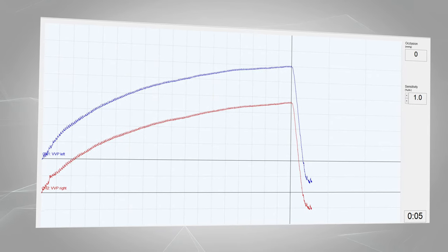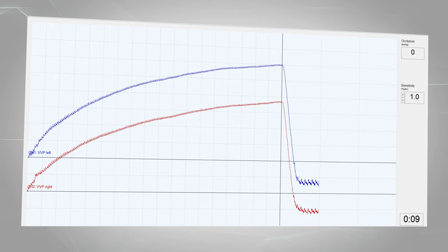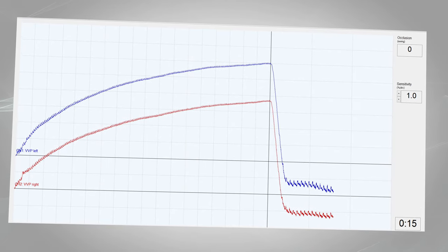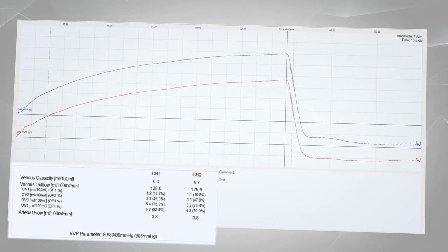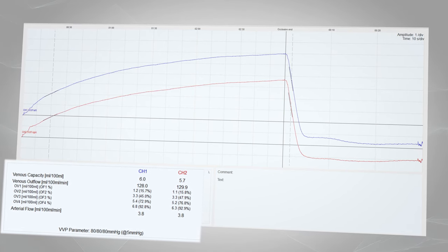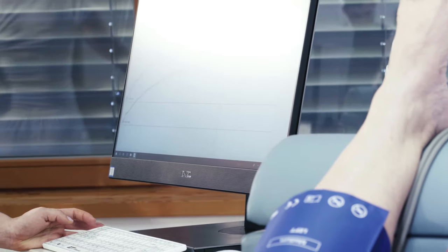When the maximum venous filling of the lower legs is reached, the pressure of the thigh cuff is suddenly released. In healthy veins, there is a rapid venous outflow. The Air-VOP uses the recording readings to determine the status of the patient's arterial inflow, vein capacity and venous outflow. The commonly used mercury-filled strain gauges become unnecessary.